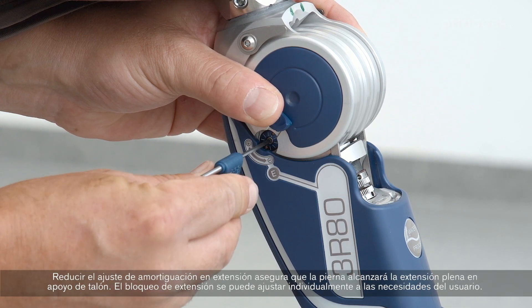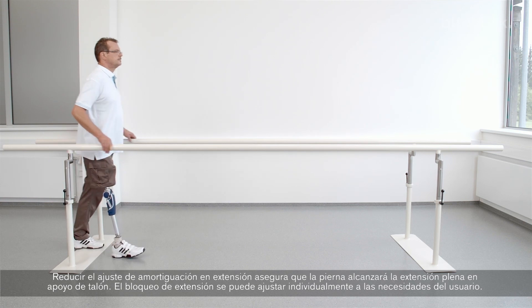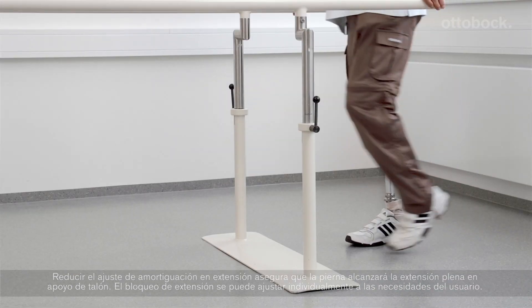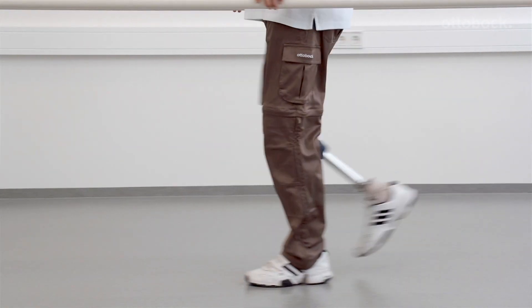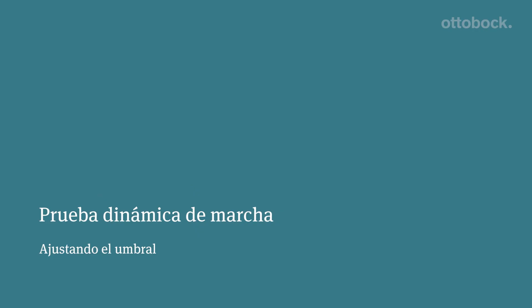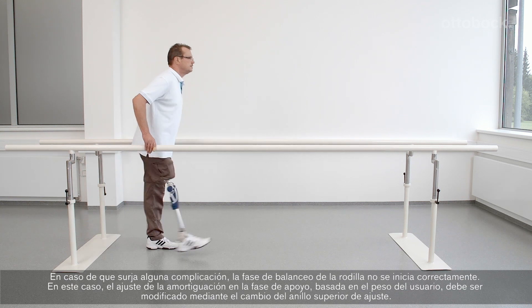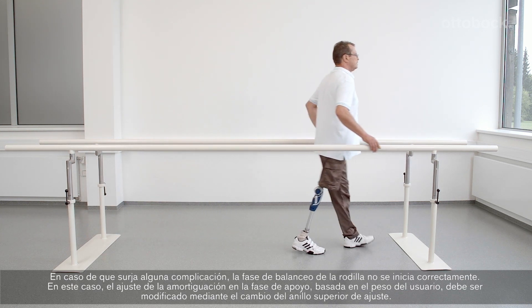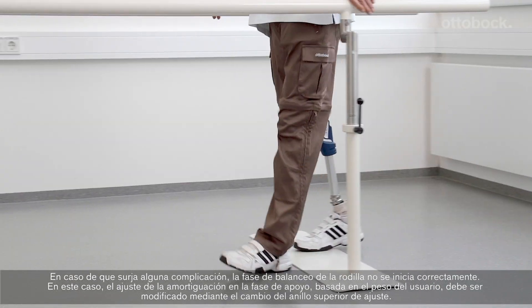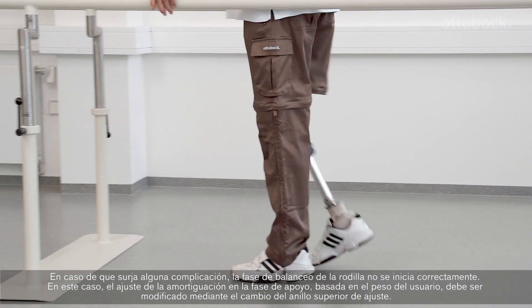Reducing the extension damping setting ensures that the leg will reach full extension at heel strike. The extension stop can be adjusted individually to the user's needs. Should a so-called hitch occur, the swing phase of the knee is not releasing properly. In this case, the setting of the body weight-based stance phase damping needs to be modified by changing the upper adjustment ring.